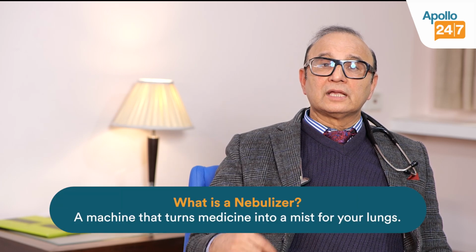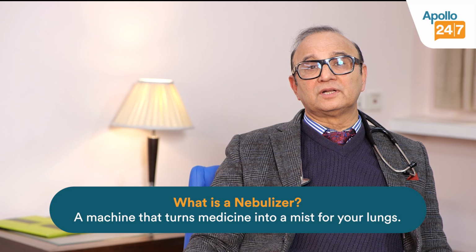Nebulizer is an equipment which converts liquids into a mist form which can be delivered to the lungs. My name is Dr. Rajesh Chawla, Senior Consultant Respiratory and Critical Care Medicine in the Apollo Hospital, New Delhi, and I'm going to tell you about nebulizers.